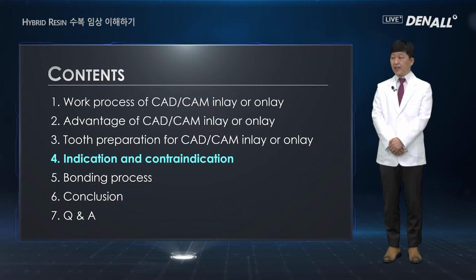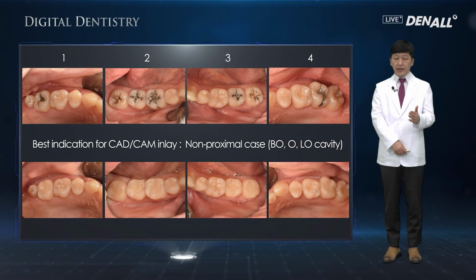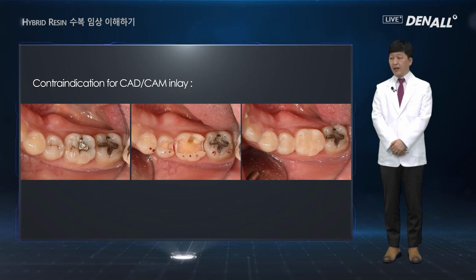Fourth, I would like to talk about indication and contraindication for CAD/CAM inlay. This is my personal opinion. First, the best indication for CAD/CAM inlay is non-proximal case. BO, buccal occlusal, O cavity, lingual occlusal cavity. Very good prognosis is observed in non-proximal cases. Moving on to contraindication.